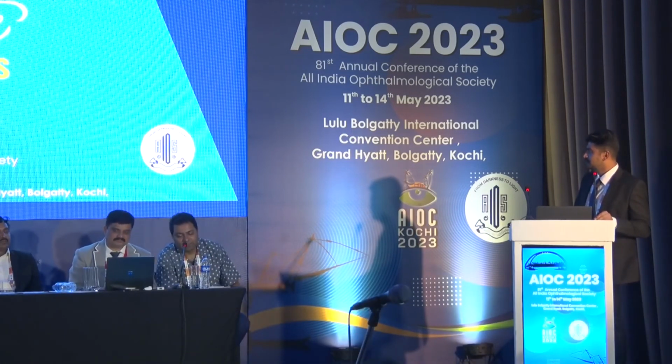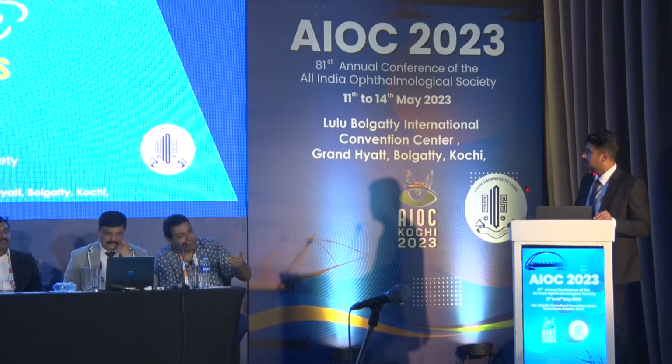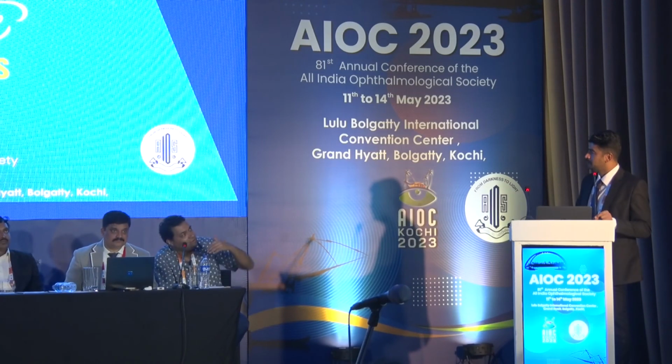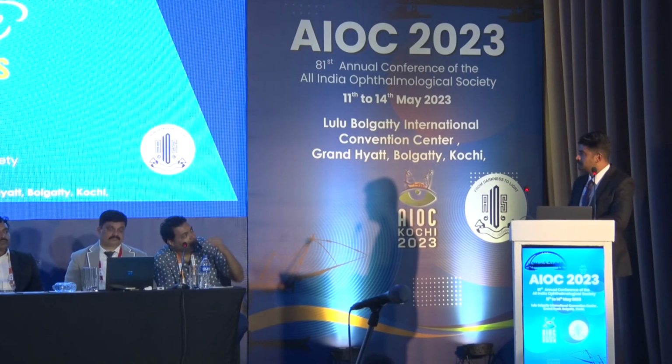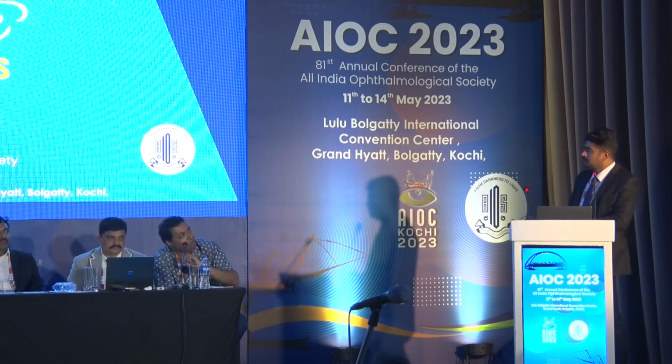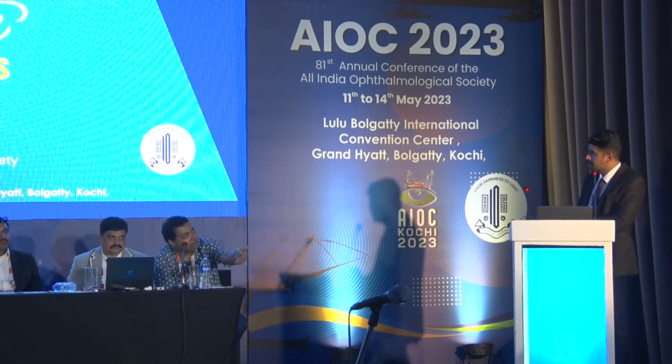One big challenge which all of us are going to face is when there is a transition from, say, the plano lenses, aspheric lenses, now the EDOF. Yeah. EDOF is heavily based on how your spherical aberration coordinates to your cornea, and how it balances or how it adds up. A small change in your tilt or the way the lens is positioned is going to be very, very less forgiving than what used to happen in the past. So your talk today really emphasized the importance of it, but it's going to be maybe a millionfold more important with the new lenses.